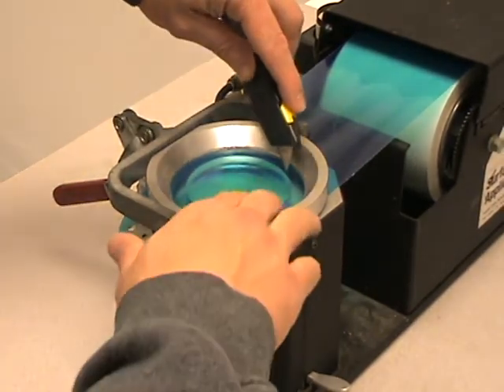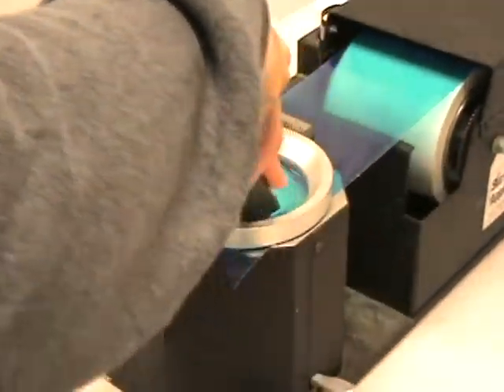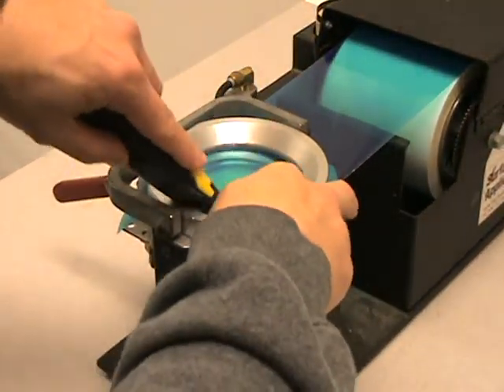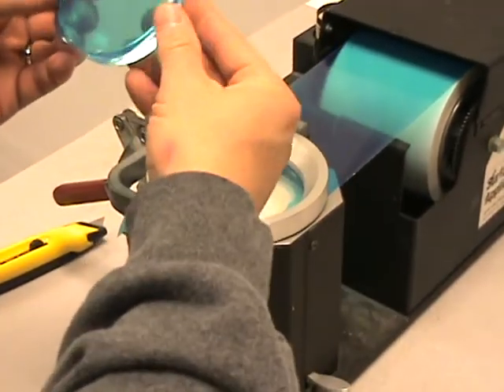So we will go ahead, take our blade and go around the very outside edge, trying to keep to the very edge of the lens if possible. Then we will go ahead and remove the lens.